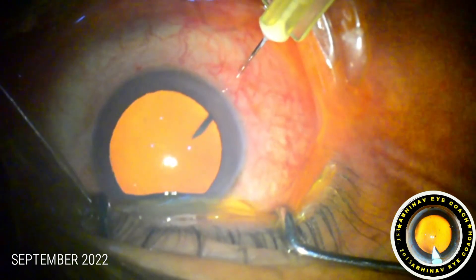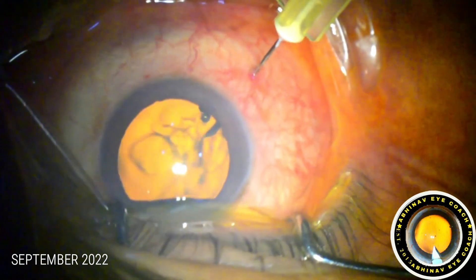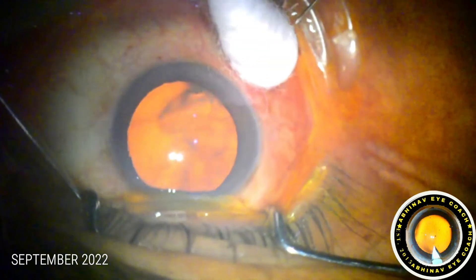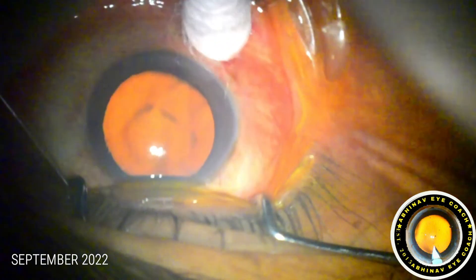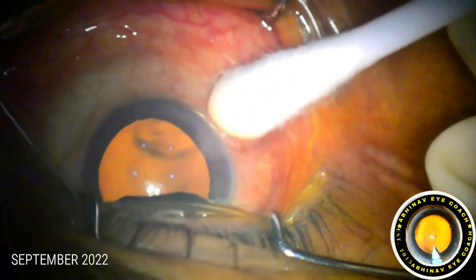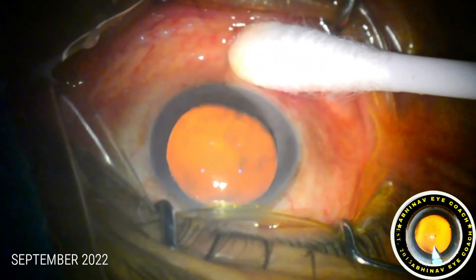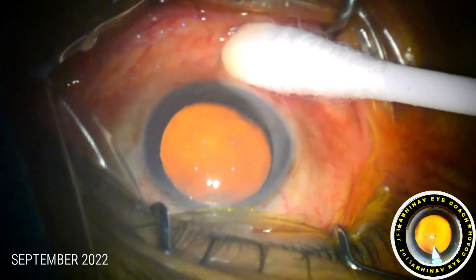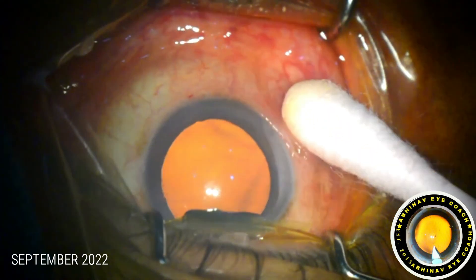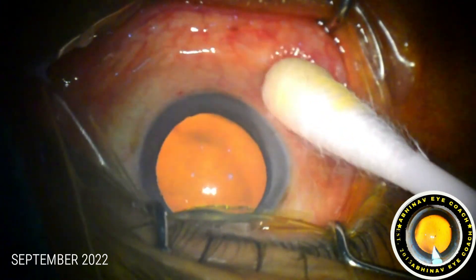The drug is administered inside the eye. The patient is instructed that they will see floaters or dark spots after the injection because of the drug itself. The injection site is then pressed with a cotton bud to avoid any leakage.